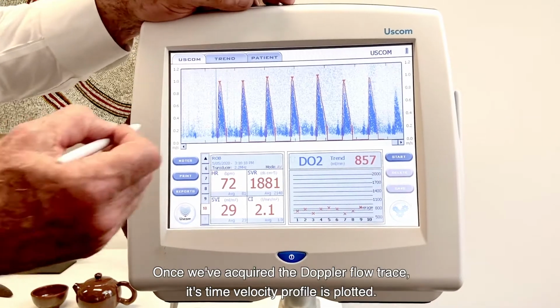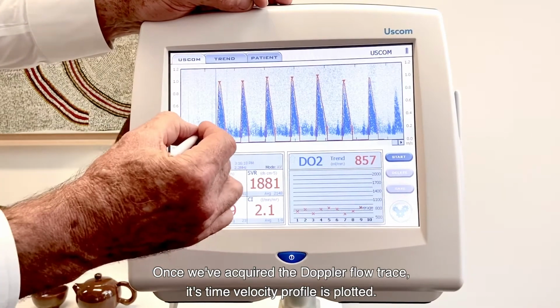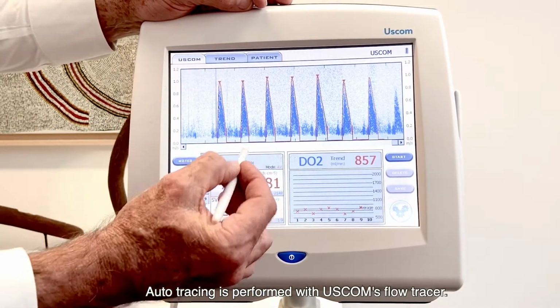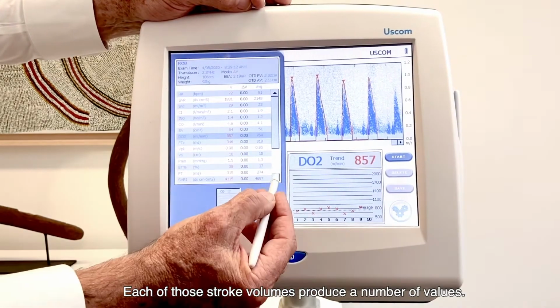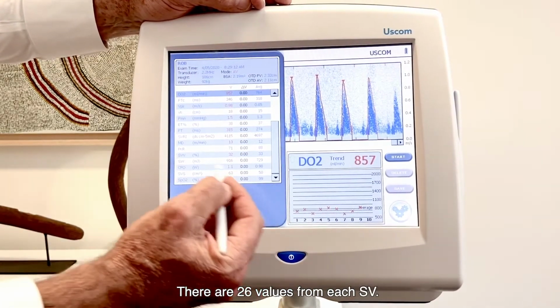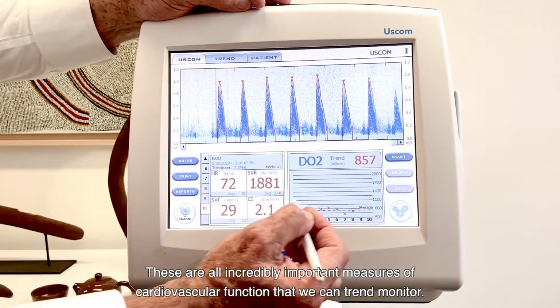So once we've acquired the Doppler flow trace, and it's a time velocity graph plot here, we've got it auto traced with flow tracer. Each of those stroke volumes produces a number of values. There are 26 values here. These are all incredibly important measures of cardiovascular function that we can trend.